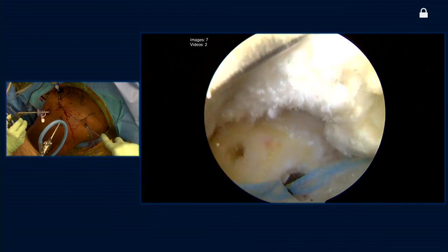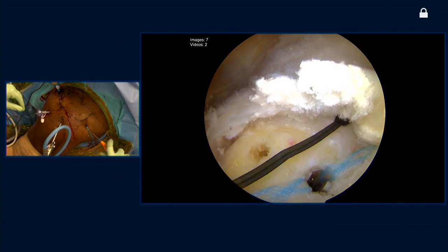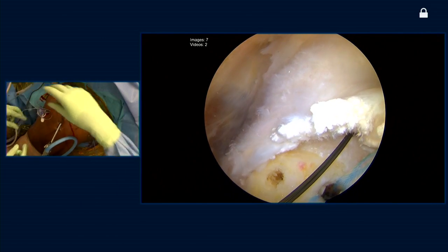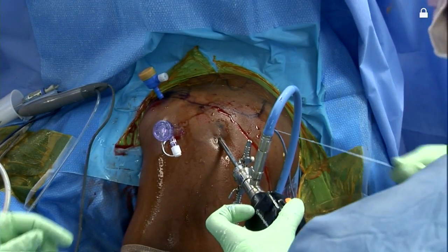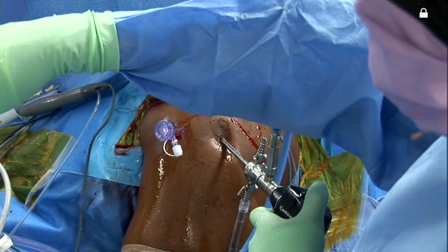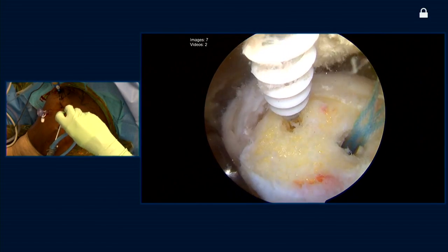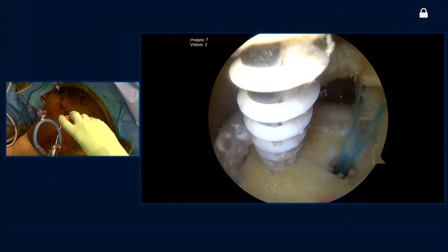Right now you're going to pass another tape through? Yeah, we're going to do a mattress configuration. This could be done actually through a single pass. My preference is to spread them out just to provide some compression on the medial aspect, but certainly you can do this passing both tapes through a single pass in the tendon — it's really dealer's choice. You can decide at that point whether you prefer to tie medially or simply do a knotless type repair. Fortunately, with the tape constructs and the improvement in our lateral row constructs, we've gone to, in many situations, a knotless configuration.